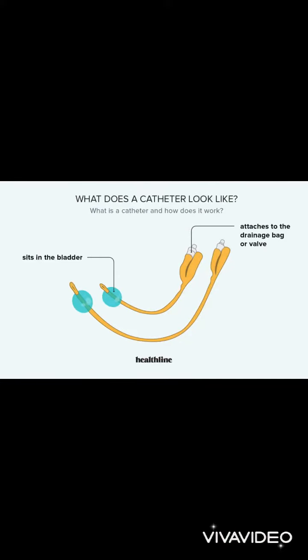Hello, today I'm going to discuss basic catheters on pictures and how they can be used for urinary output measurement. So first, let's discuss what the types of catheters are and how they look.